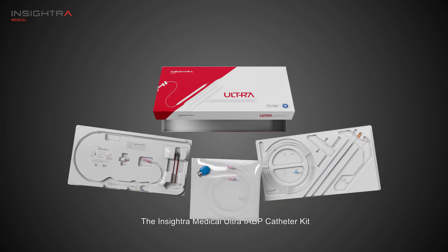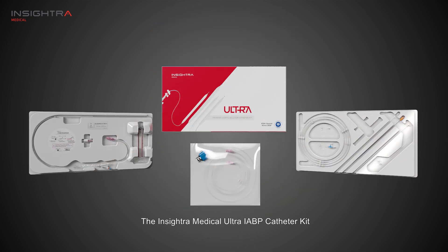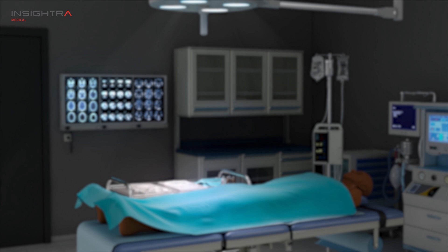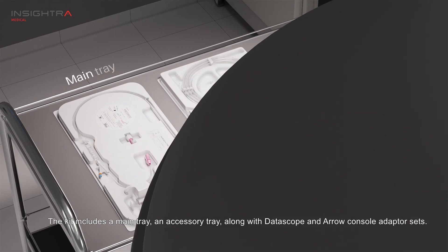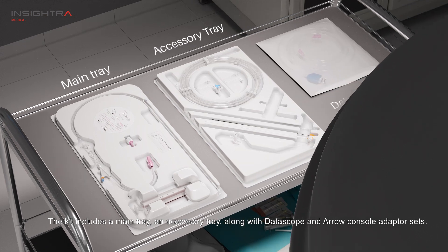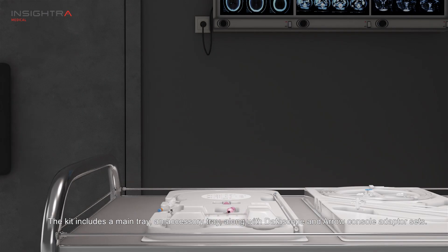The InSitra Medical Ultra IABP catheter kit. The kit includes a main tray, an accessory tray, along with data scope and arrow console adapter sets.